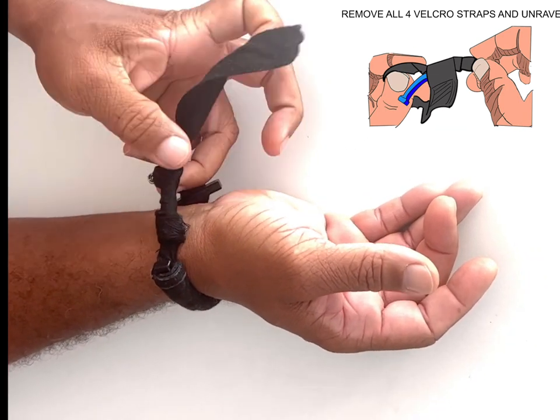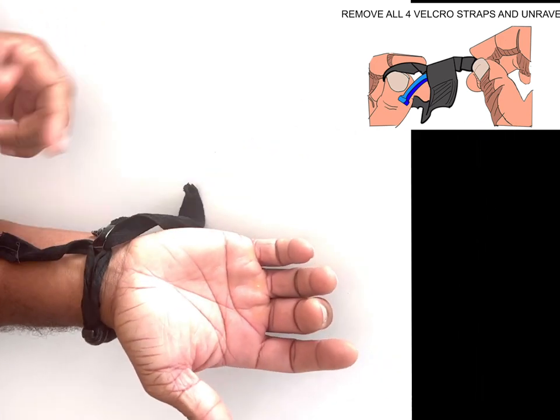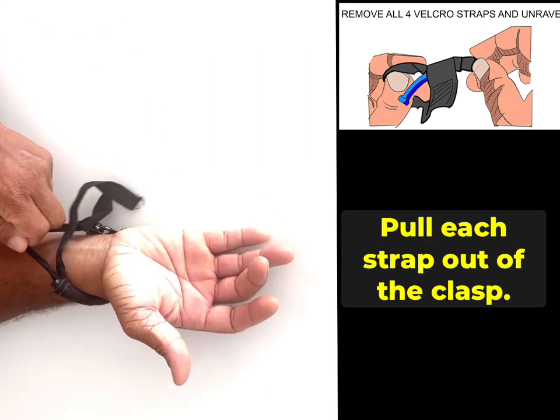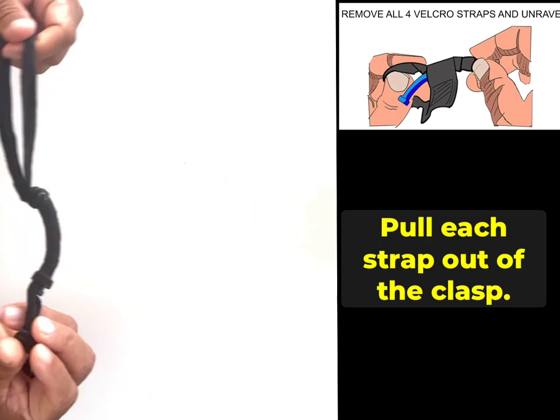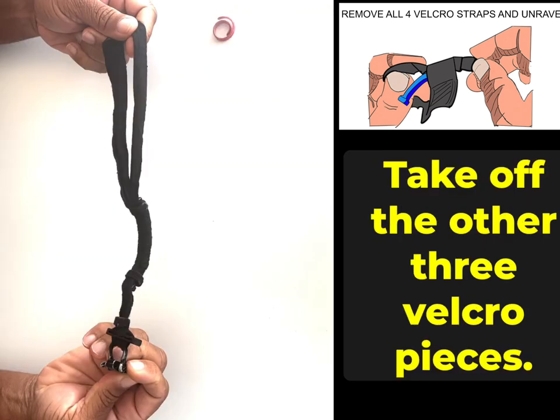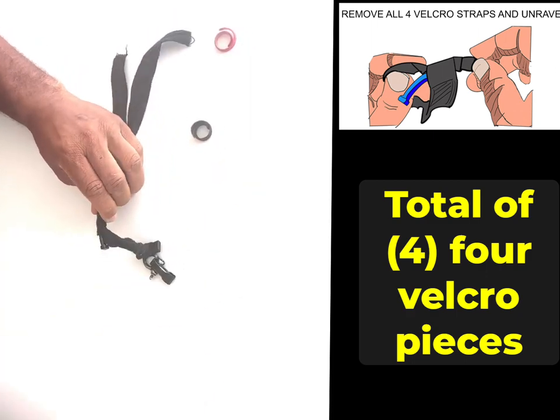Once you take that red one off, this can be unraveled — it wraps around twice. One direction here's the first direction, pull it out and pull it out, and now it's off your wrist. You need that to stay connected so that you can use it as a tourniquet. Now you have the other three velcros to take off.